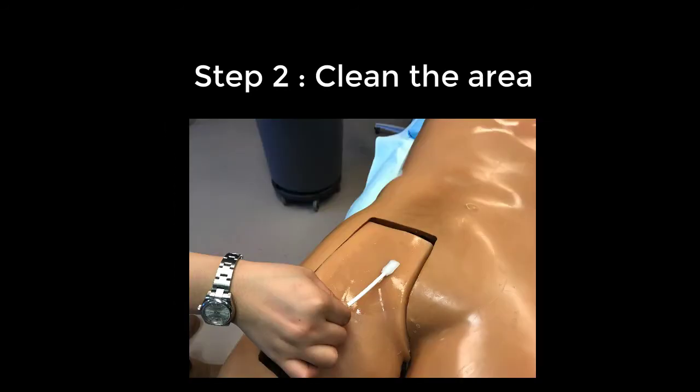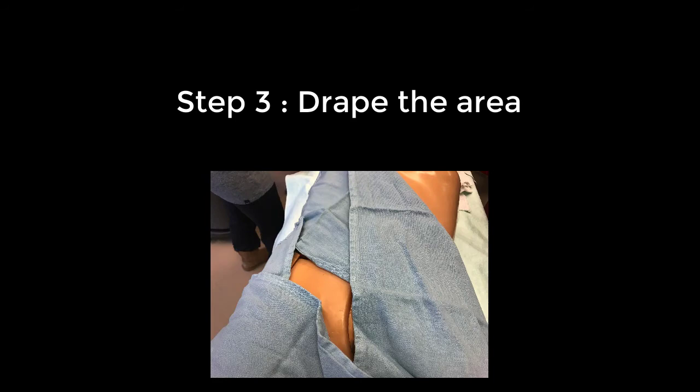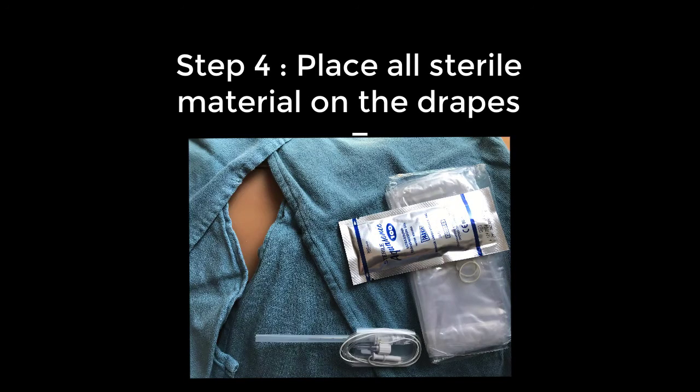Next, clean the area with the chlorhexidine sticks. Drape the area with the sterile towels. Place the sterile ultrasound probe cover and gel as well as the sterile needle onto the sterile field.